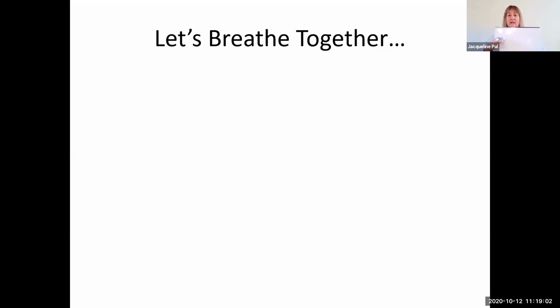Okay, just take a normal inhalation and then a normal exhalation. And then another inhalation and another exhalation. Now breathe in again as much as you possibly can. Okay, now blow it all out. Keep on blowing, blowing, blowing, blow it all out. And then take another inhalation and exhalation at the end.